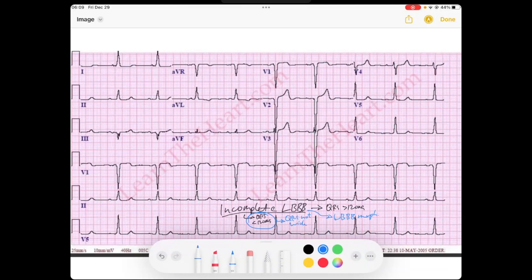If you look at this EKG, we're going to look at just the QRS complexes, because the QRS represents ventricular depolarization. We can see the QRS complexes are not quite greater than three small boxes — they're still about 100 milliseconds — so this is not wide. This is not a complete bundle branch block, but we still see left bundle branch block morphologies.